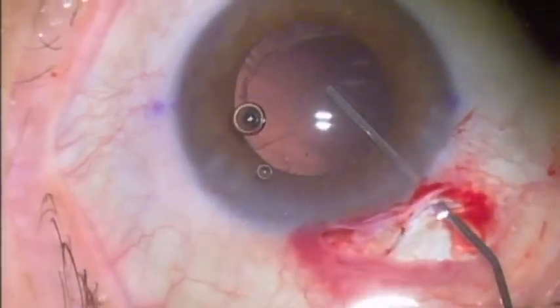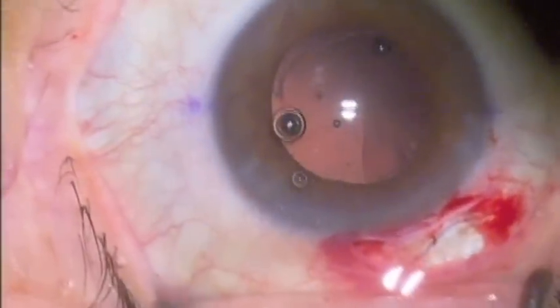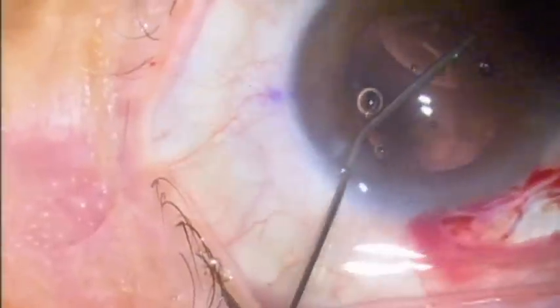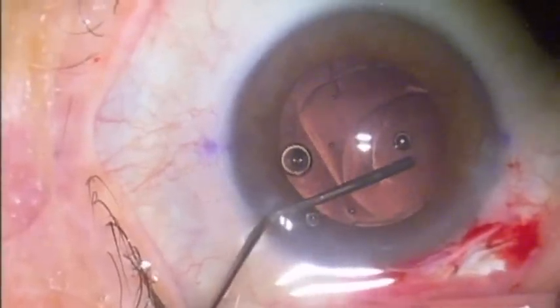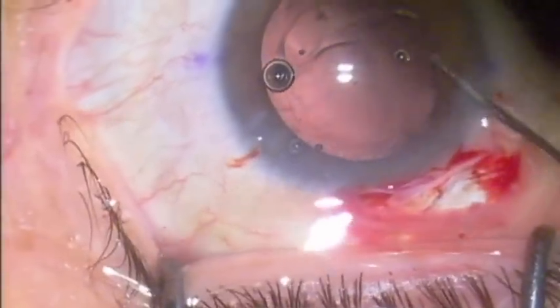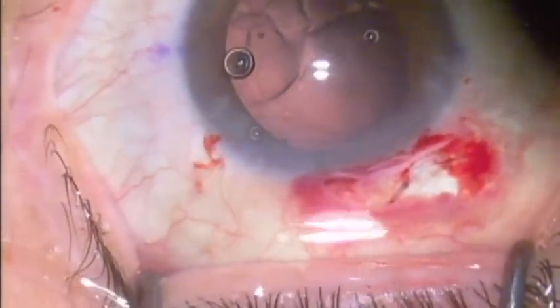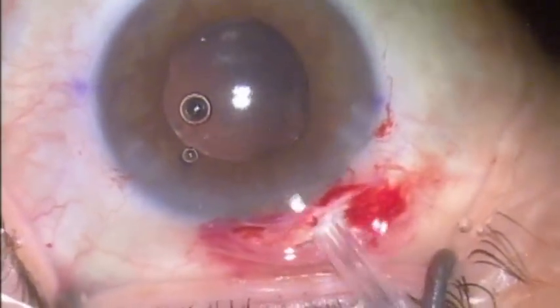At this point, the capsular bag is dilated with viscoelastic. A decision I hadn't made previously was to use a capsule tension ring to stiffen up the capsular bag and provide more even zonular distribution forces on the implant when we replaced it, to prevent the recurrence of Z syndrome. We're dilating the capsular bag with viscoelastic and now I'm going to insert a CTR.